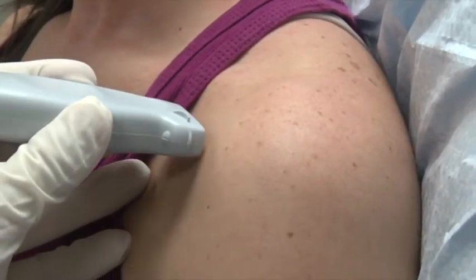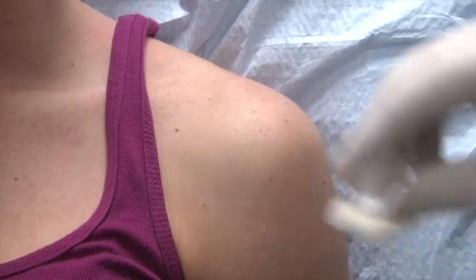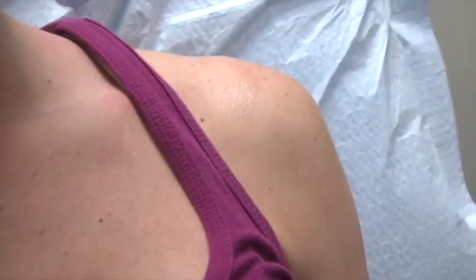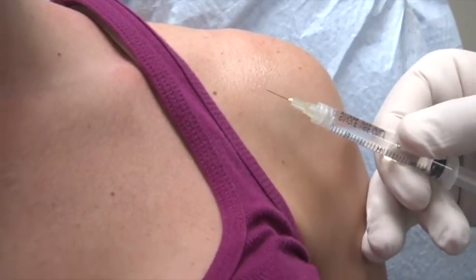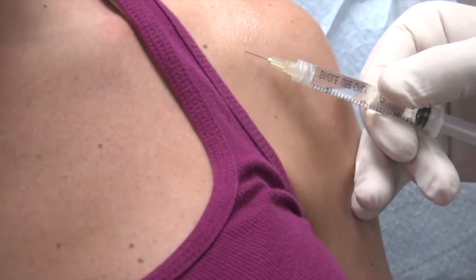Place the ultrasound probe in a transverse position between the humeral head and the coracoid process and confirm effusion. Prepare the aspiration site using sterile technique. Inject local anesthetic superficially, avoiding injection into the joint space. If infection is suspected, introduction of anesthetic may cause false negative culture results.